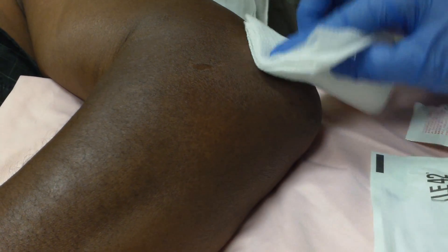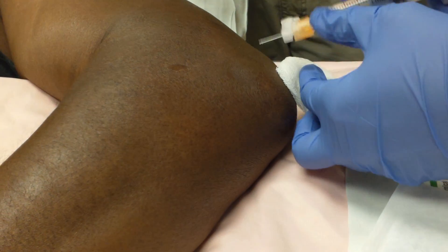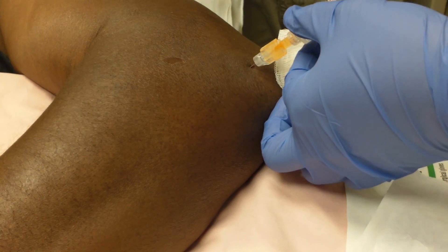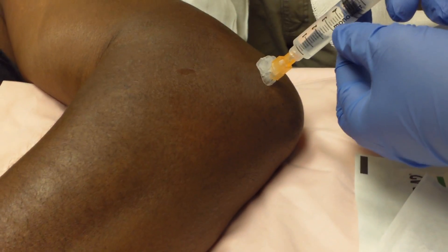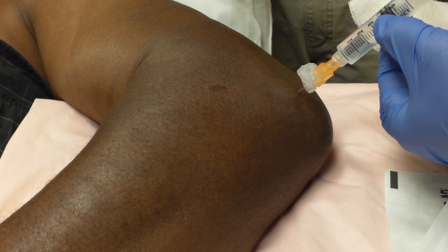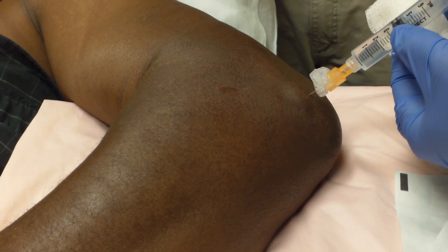So the arm swelling has been going on how long? About two days. He's had some joint swelling in the past — is that true? Yes. So he may carry a diagnosis of gout, but he's got marked limitation in range of motion on this elbow.